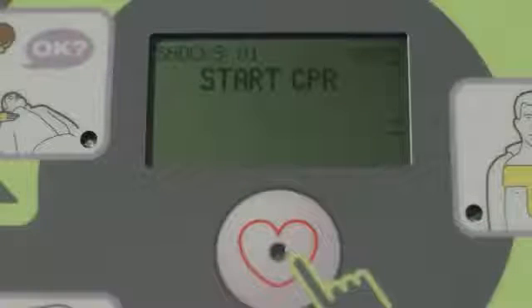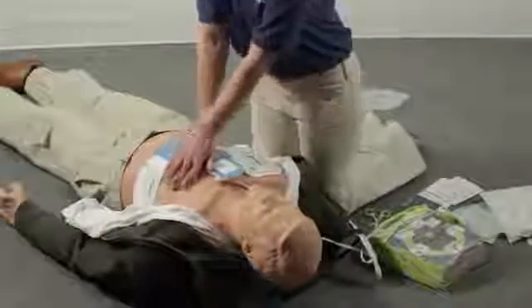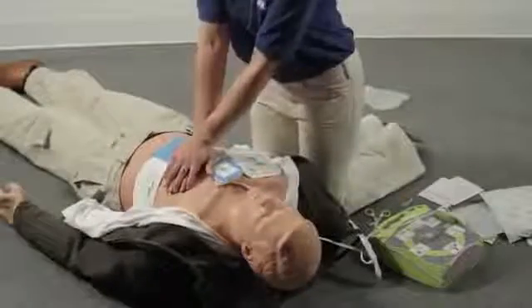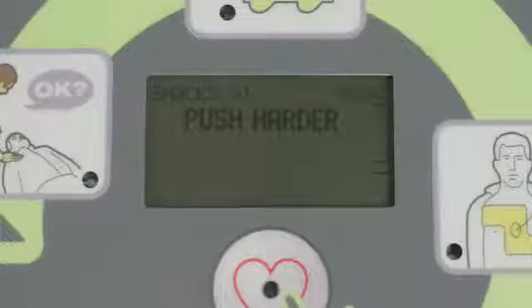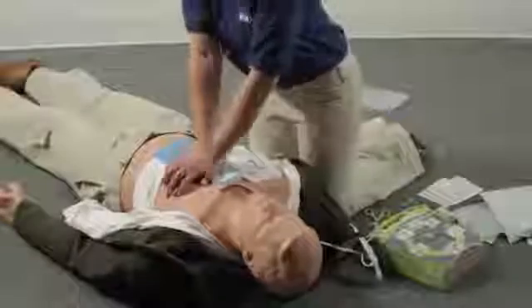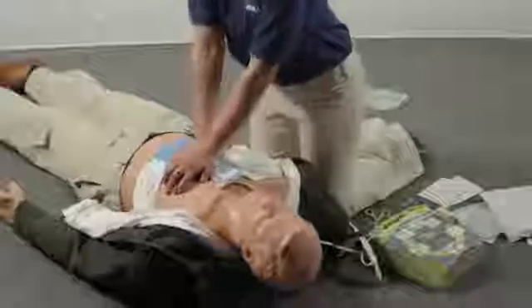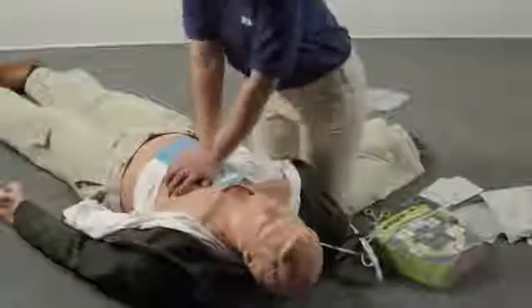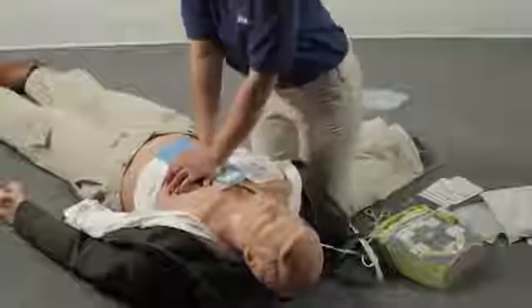After the shock, immediately start CPR. Do your compressions by pushing down on the CPR landmark. If your compressions aren't at least 2 inches deep, the AED Plus will let you know. The AED will say "Push harder" every 15 seconds if you don't reach the target CPR depth. After being told to push harder, if your compressions reach at least 2 inches, again, the AED Plus will let you know with "Good compression."